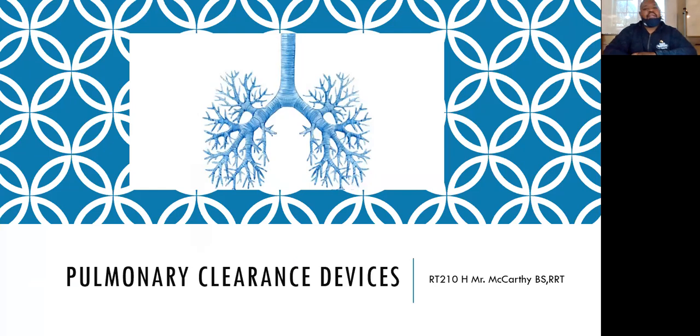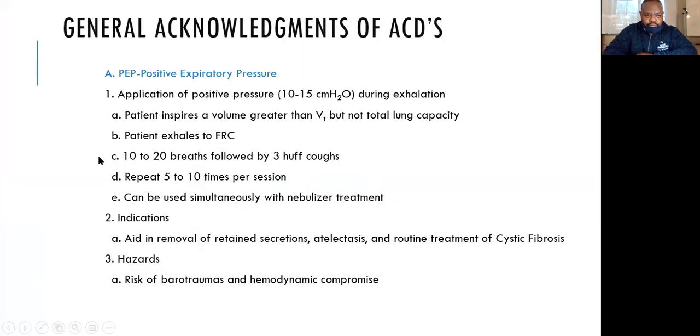All right, so here go some of the pulmonary clearance devices, okay? Positive expiratory pressure, which is PEP therapy, right? PEP, P-E-P, positive expiratory pressure. So what happens is they blow into a device and it gives them back pressure, okay? Application of positive pressure, 10 to 15 centimeters of water during exhalation. So they take a deep breath in and then they blow into the PEP device, okay? So look at A, it says patient inspires a volume greater than tidal volume, right?